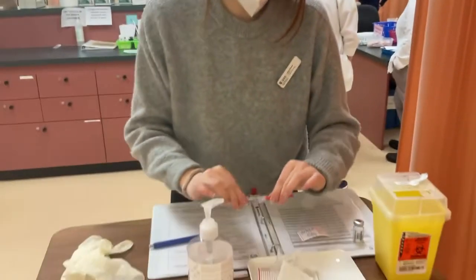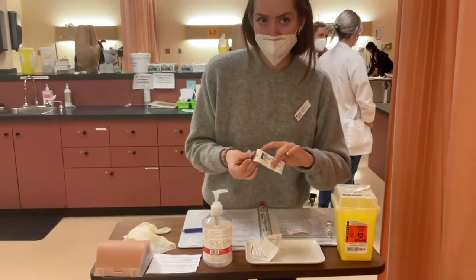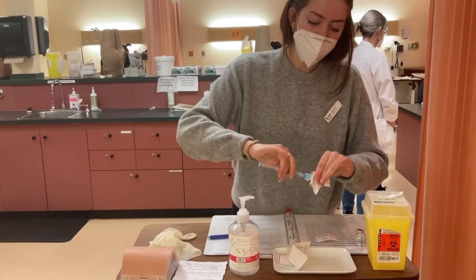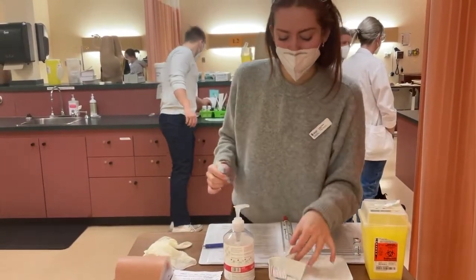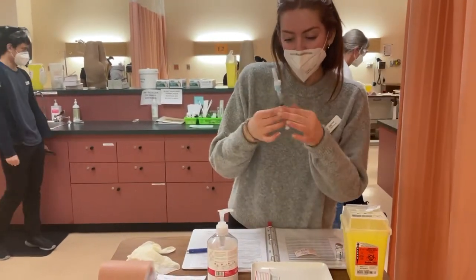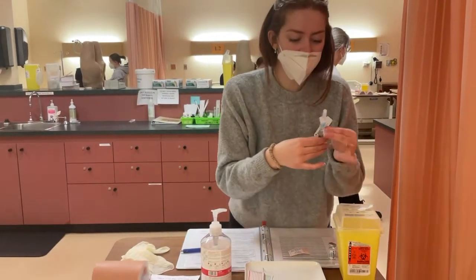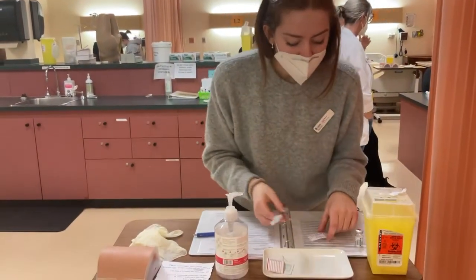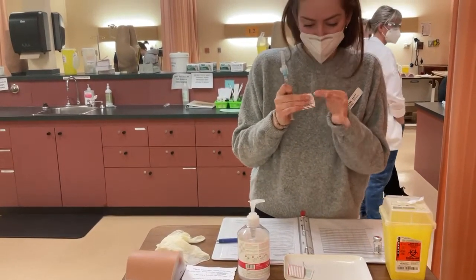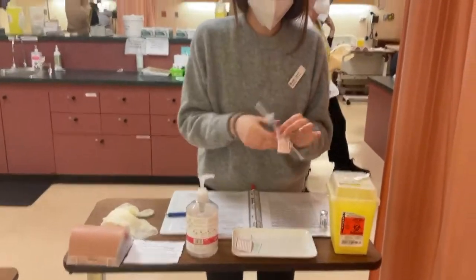Okay, now I can remove the blunt fill and place it in the sharps, and I can connect the 23 gauge needle to my syringe. So when I connect, I want to calibrate to the correct dose, which is 2 milliliters. Over the garbage, I will connect, and now it is the correct dosing. So I will connect the drug label to my syringe, and it's good to go.